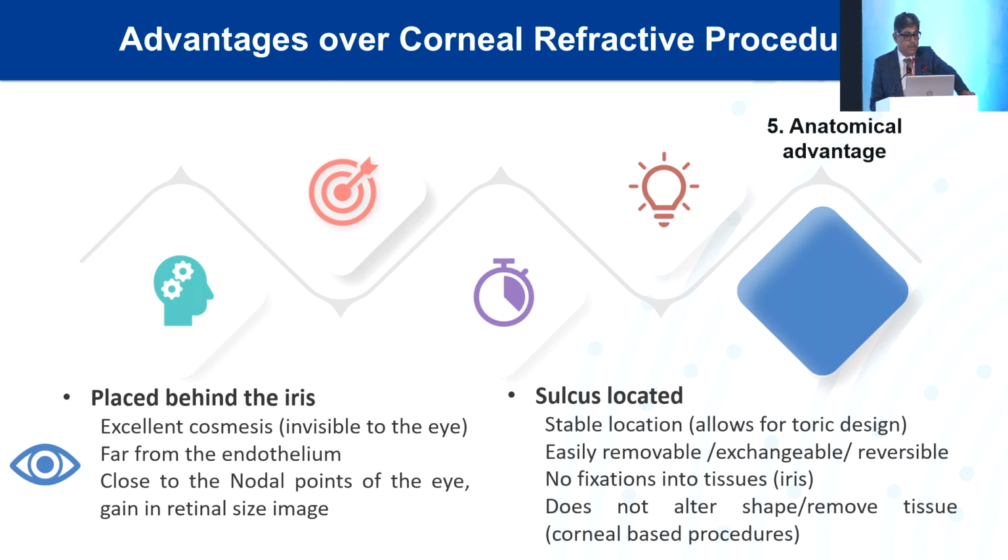There is no damage to the endothelium, and close to the nodal point of the eye, so there is a gain in the retinal image size and better quality. You all will agree that we see an increase in vision in the post-operative period in high refractive error cases.